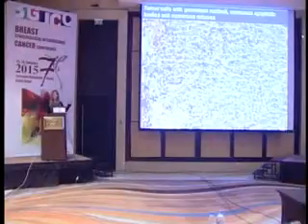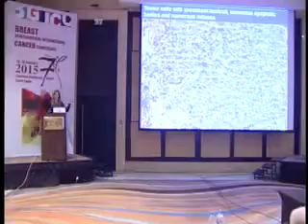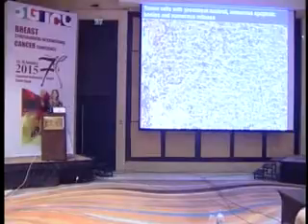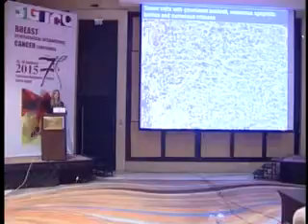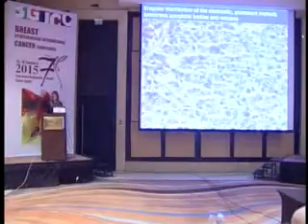Folding, but you have cytoplasm. This is why it throws you off, because in the small cell, you don't see cytoplasm. The nuclei hug each other. We call it molding. But in the large cell neuroendocrine, you see cytoplasm. But you always think about there is large cell and small cell.